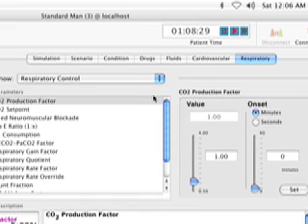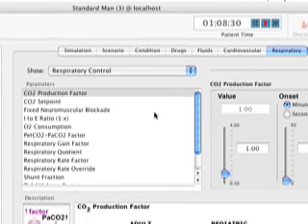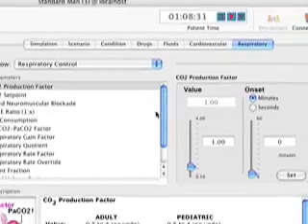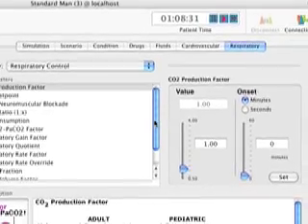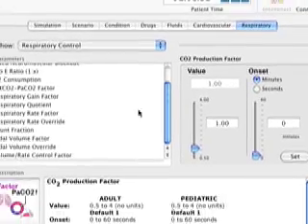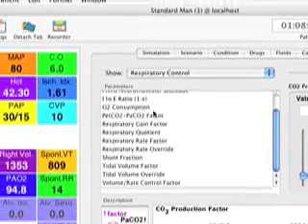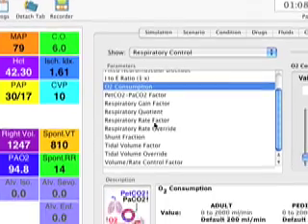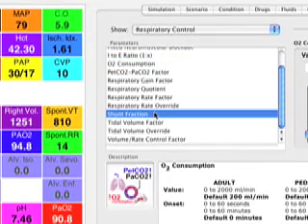And there's a couple of very easy ways to make Stan hypoxic using this menu. One is oxygen consumption, O2 consumption, and the other way is shunt fraction.